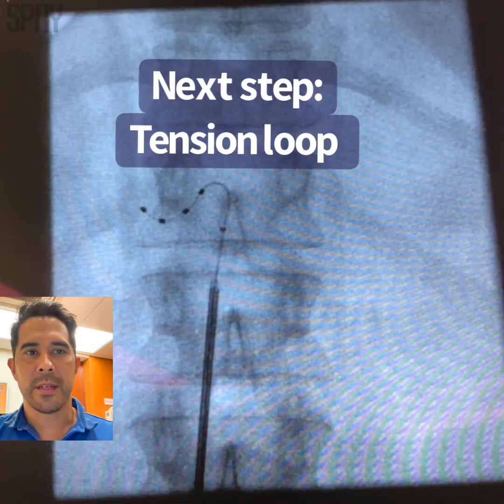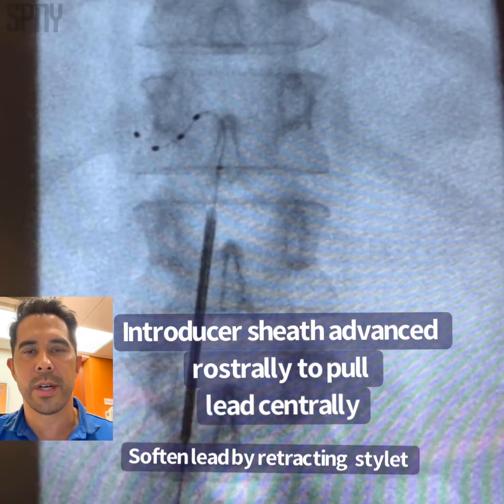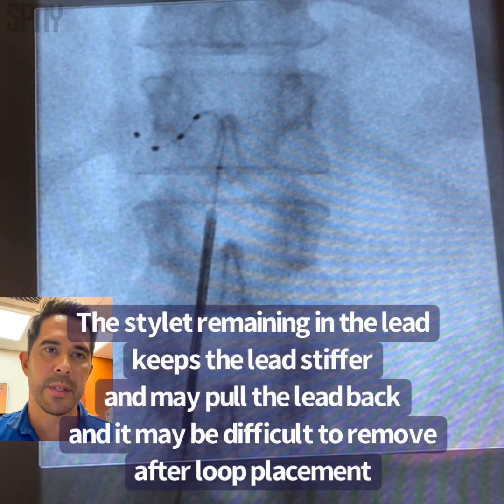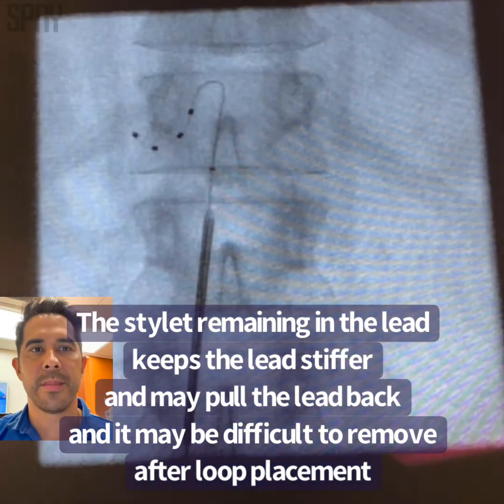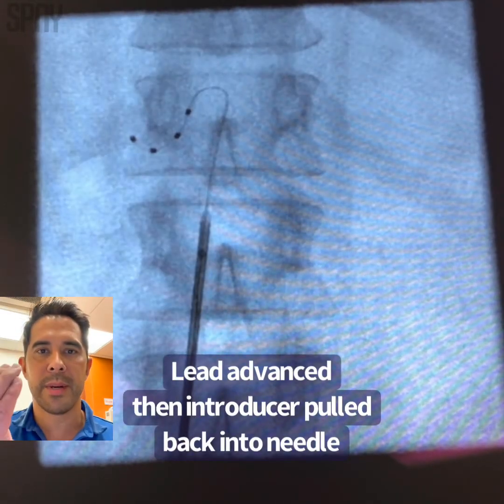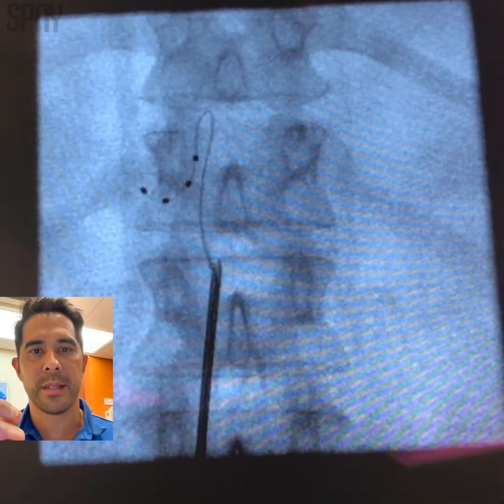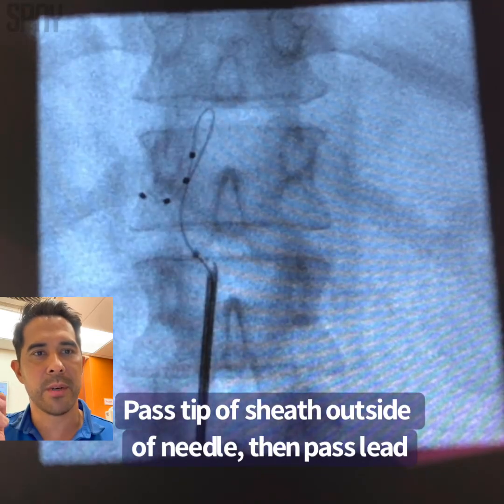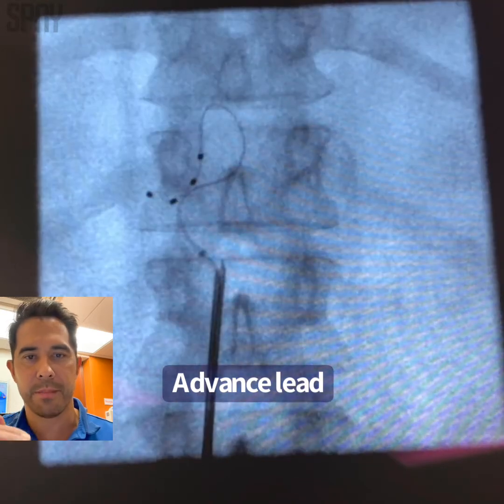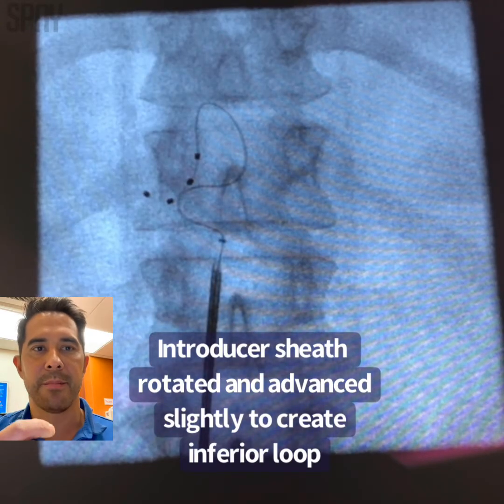For the tension loop, I believe in manipulating the introducer to try to direct our lead to where it wants to go. First we advance to create that cephalad loop. And now to make the bottom loop, we're going to turn the sheath — pull it back and turn it towards the foramen. The stylet is going to be pulled out to make the lead a little softer. Here's the lead. Now we advance the lead a little bit, and we want it to catch against the wall to form that bend. Just that bend right there is going to catch it — now take the sheath back to the middle, advance it and pass it.